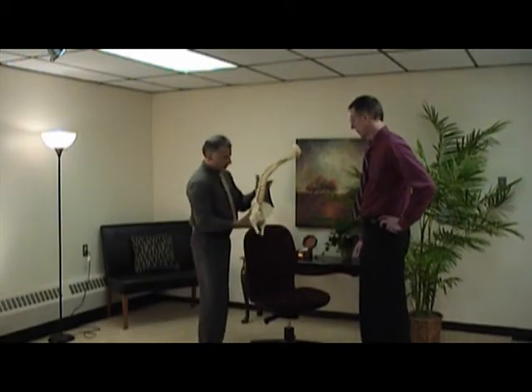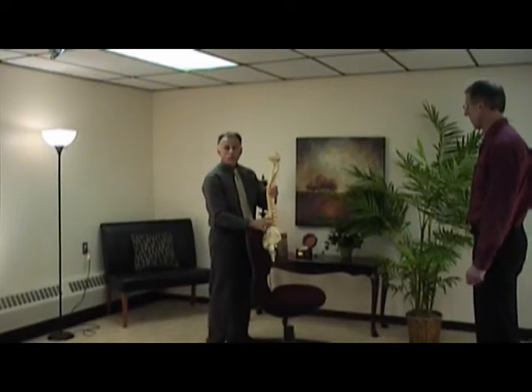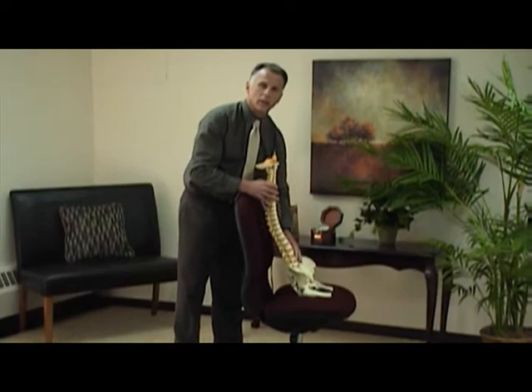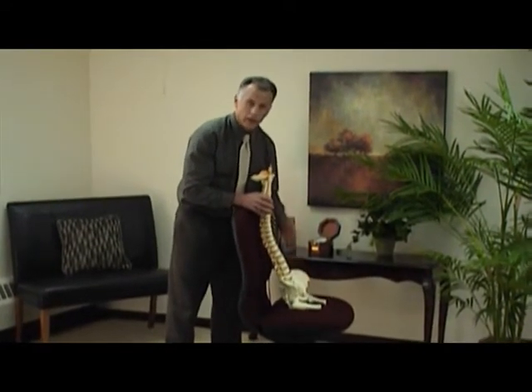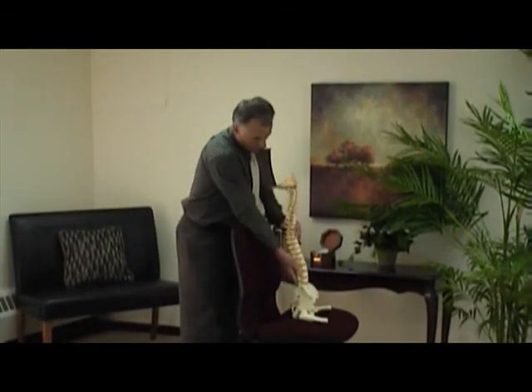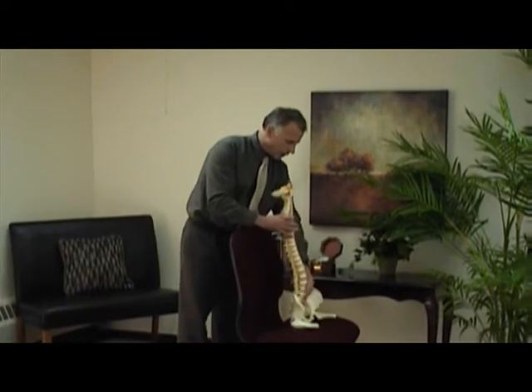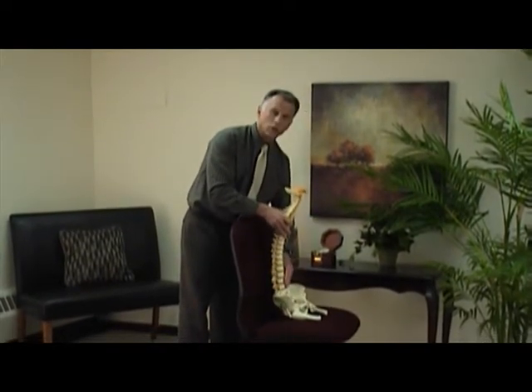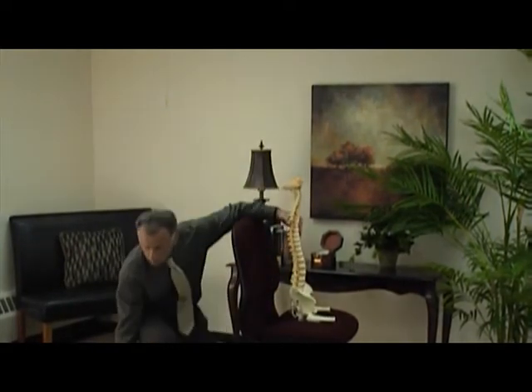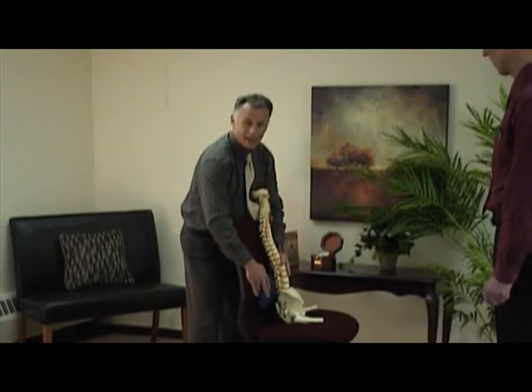Okay. Seriously, the lumbar support supports the lumbar spine, which is the lower part of the back. That's where the majority of back injuries occur. And believe it or not, sitting with poor posture is one of the most common irritants of low back pain. Bob and I see that in the clinic all the time. We address seated posture and proper seated posture all the time. If you look at the spine, it naturally has a curve going in here, and we want to maintain that curve when we sit. Now, oftentimes what happens when we sit is it goes the opposite direction, goes into that C shape, and what we need to do is fill the gap in here to support that, and that's where we put the lumbar support, and it helps maintain that, okay?